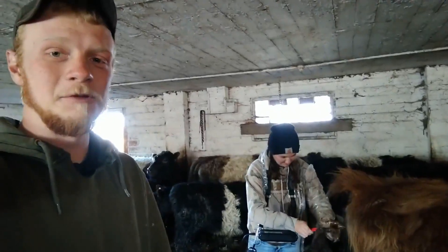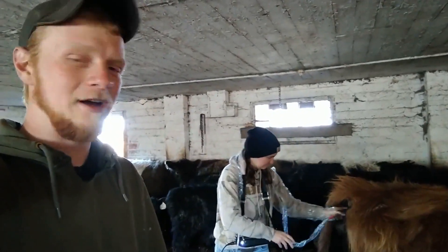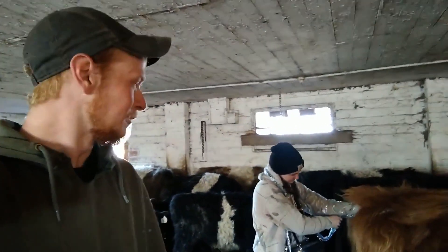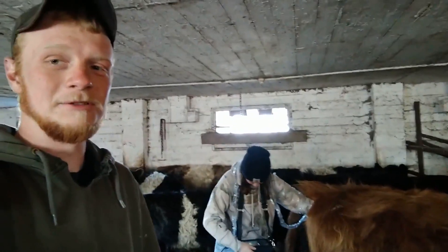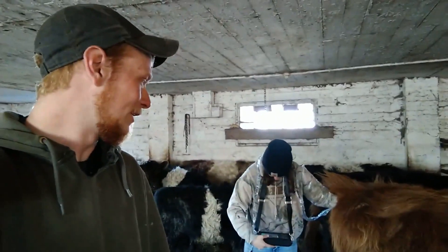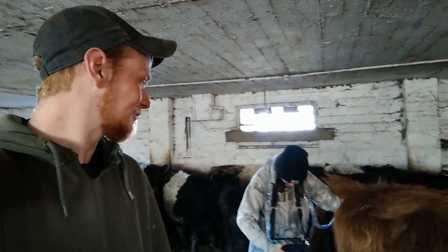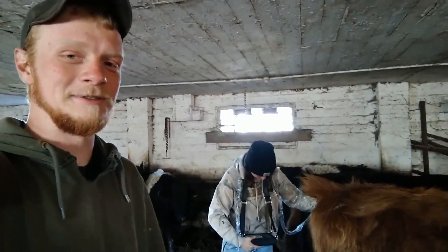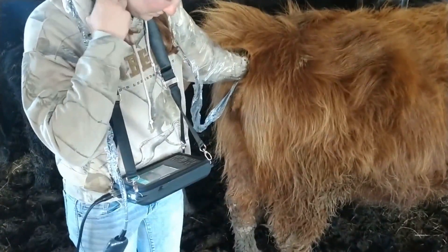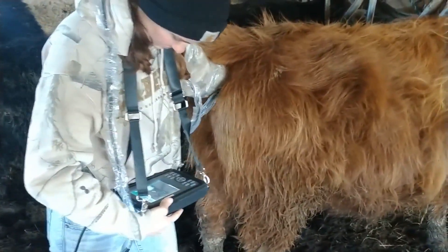Hopefully we'll be able to show a better picture, give us some more information, and make our preg checking a little more accurate. Not much of a how-to video today since we're kind of figuring out how to use it ourselves — new technology as we go.